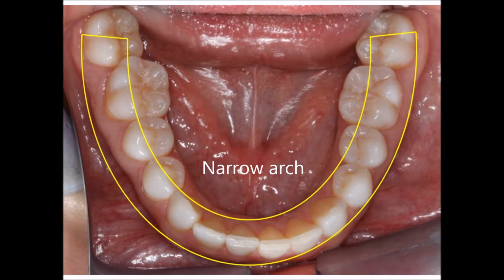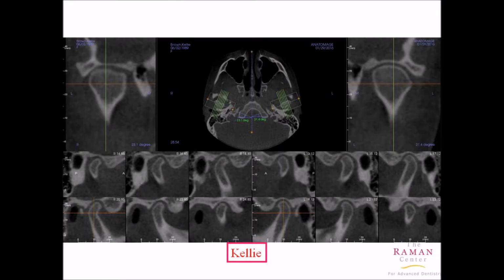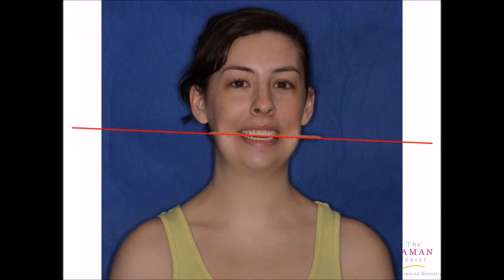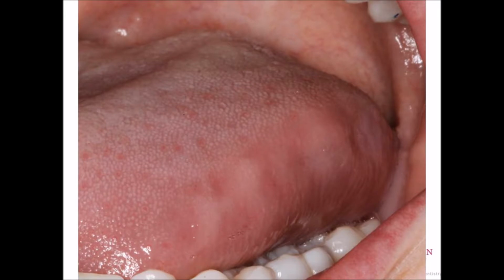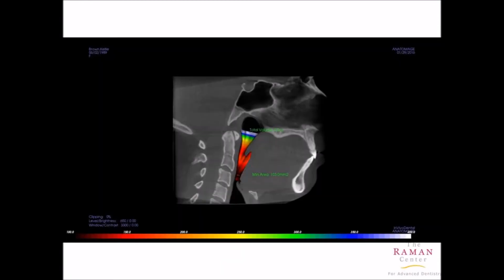This next image shows her temporomandibular joints were compressed both up and down and towards front to back. This one shows her jaw alignment. The bite alignment is tilted as well as her shoulders in the front, and from the side view her neck is forward because she's compensating for not having enough room for the tongue, and so that the airway is better for the neck forward. And measuring the airway with the CT showed it is a compromised narrow airway.